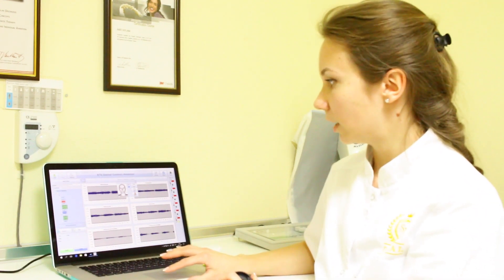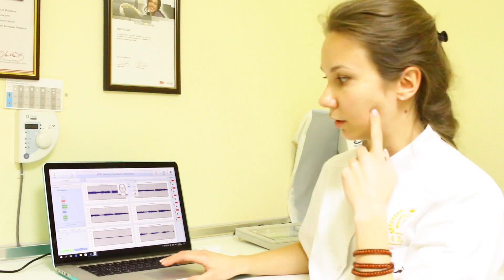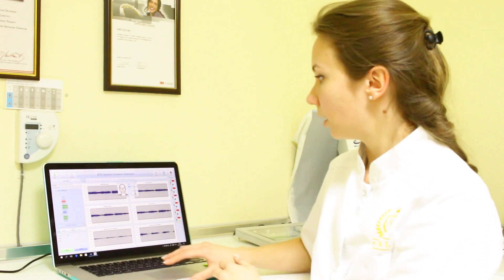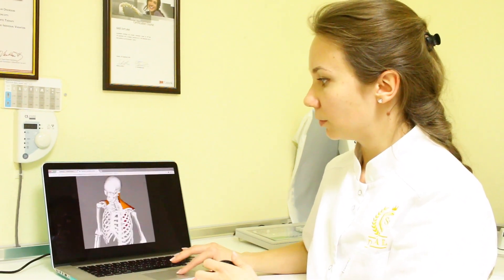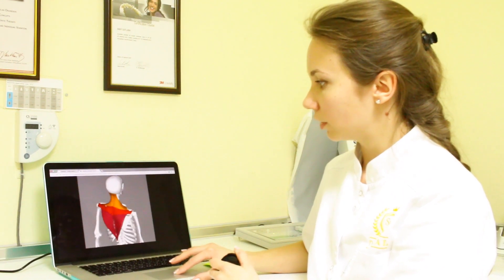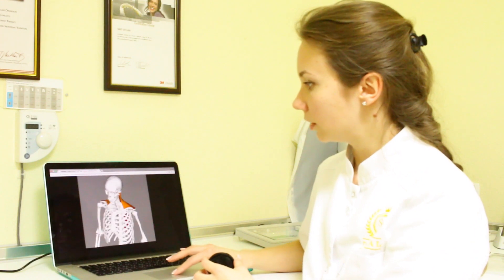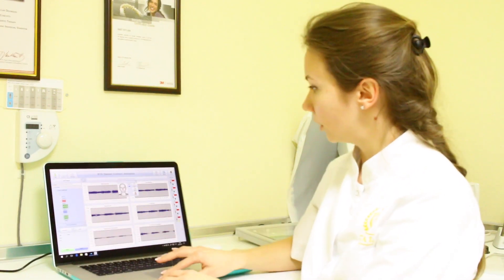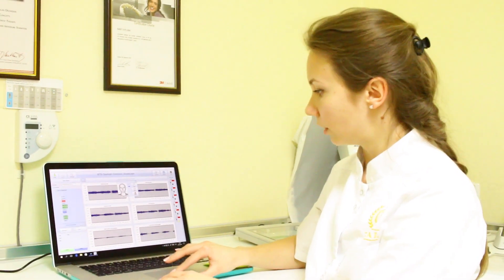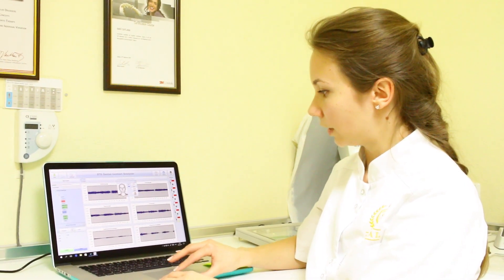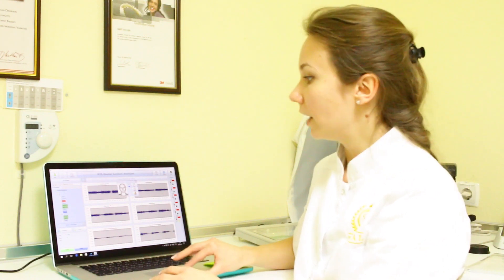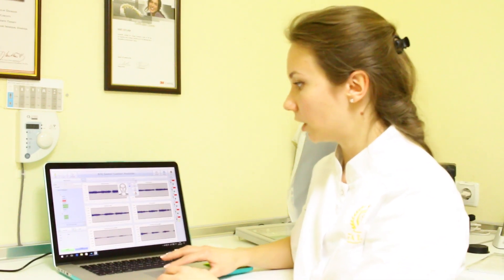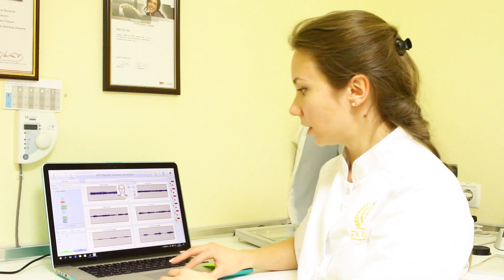We discovered that this patient had her neck muscle pain connected with her chewing muscles. If you watch here, you can see that her trapezius muscle — this is the muscle that was aching on her left side — is strongly connected with her chewing muscle. This is the first trace: her left masseter. We had the same activity in her left neck muscle and her left masseter. Then we made our T-scan adjustment, and now we have left neck muscle and lower left masseter activity.